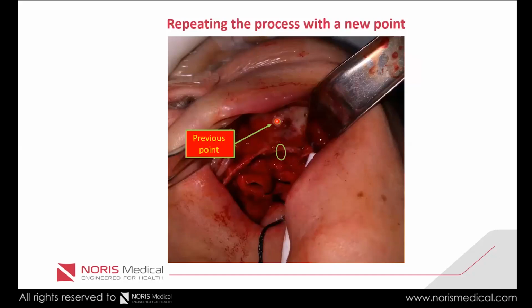And basically we want to move this hole to a different position. So we make another mark. Now these marks are not the entering point. They're just marks in order for us to define the line, the sinus, the orbital angle. So we might make another mark.